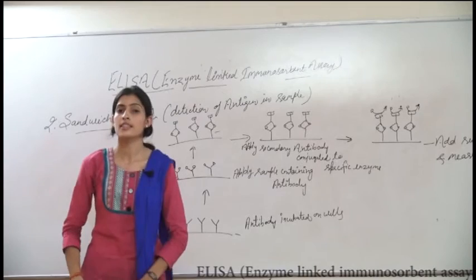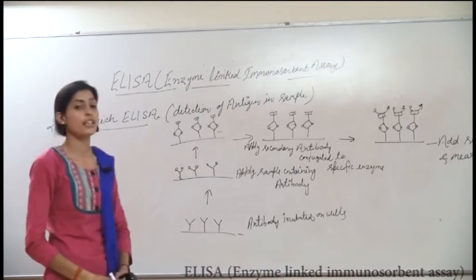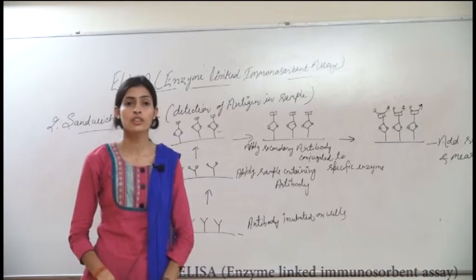As in indirect ELISA we can measure the concentration of antibody, but in sandwich ELISA, we can determine the concentration of antigen in our sample.